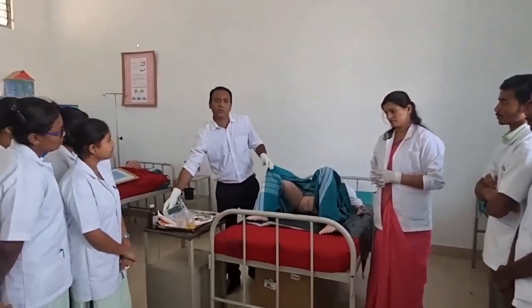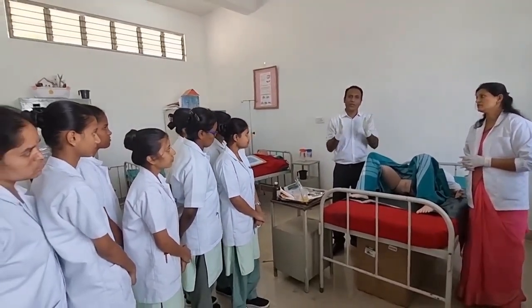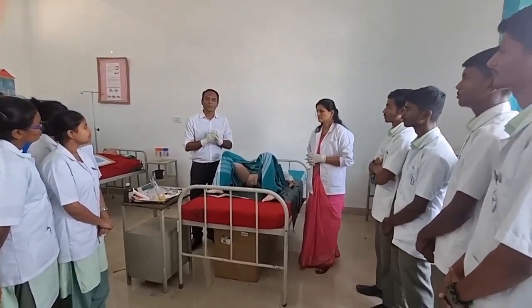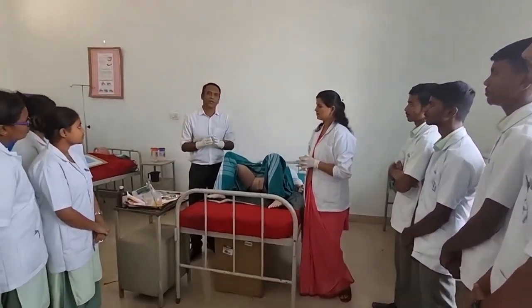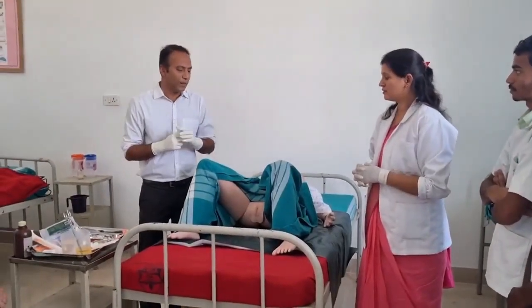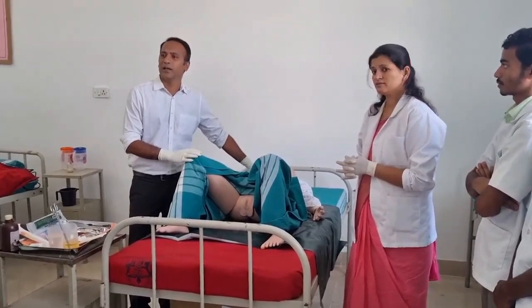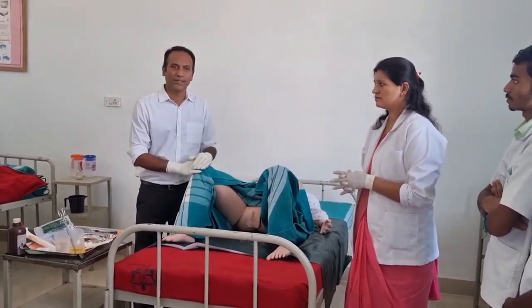Of course, we will wash our hands and we will have two pairs of gloves, because I am going to remove one pair after cleaning the perineal area. To save time, assume that hand washing is already done, and we have put on the two pairs of gloves. Secondly, winning the confidence of the patient. Always explain the procedure to the patient. It will reduce their anxiety and you can get their cooperation as well. These are the basic things.